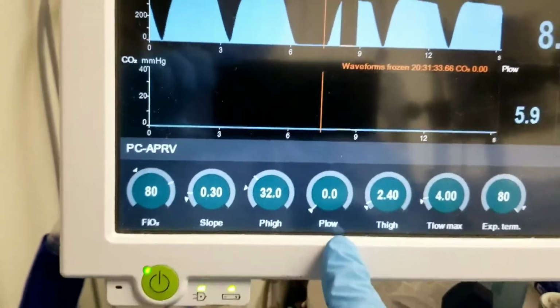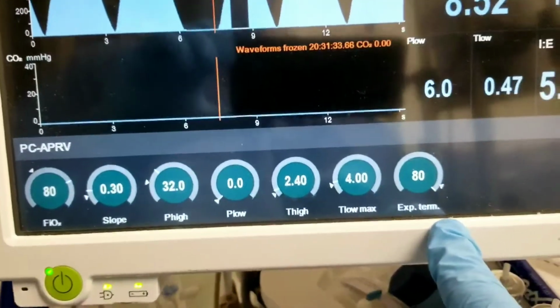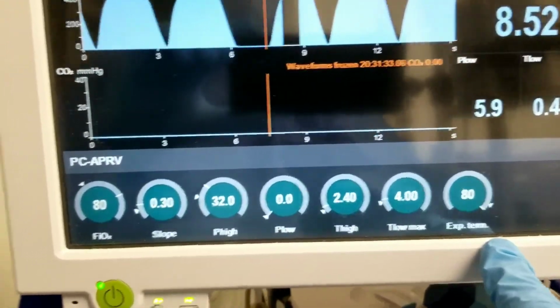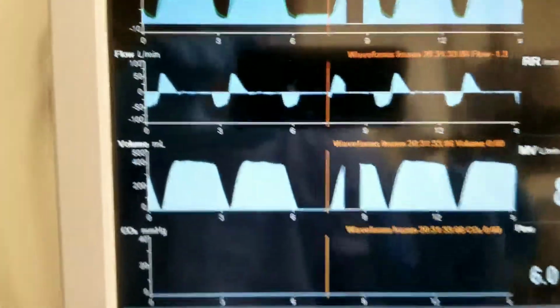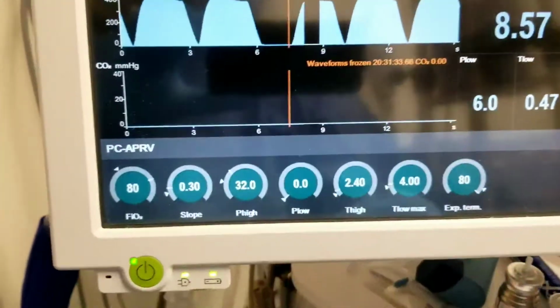Now they don't suggest, since this here is never going to allow us to expire down to a very low P low level, so we don't have to set that because this thing is continually doing the calculation. It's always going to put the lung in the optimal position on the pressure volume loop. Okay.